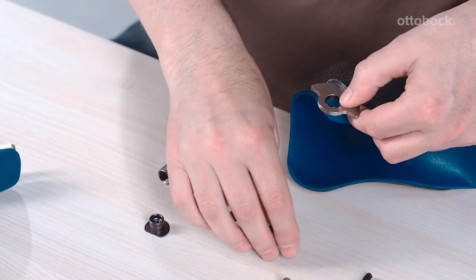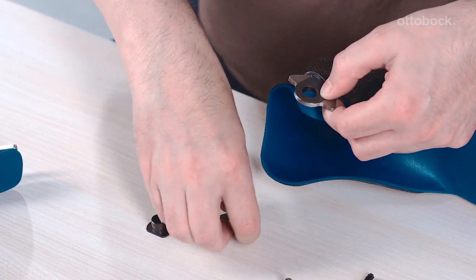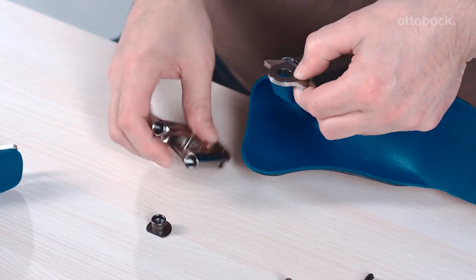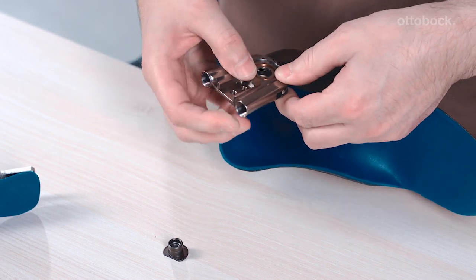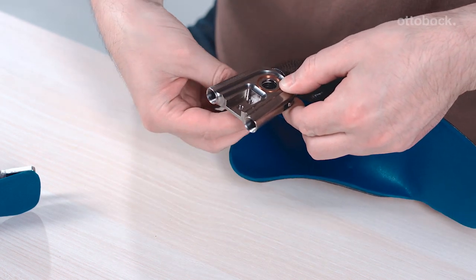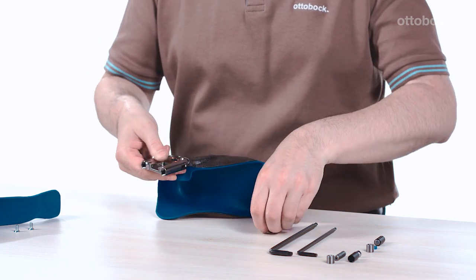First, the basic piece must be installed on the foot stirrup. Reinsert the bearing bushing into the foot stirrup. Then place the two axial washers on the foot stirrup. Slide the foot stirrup together with the axial washers into the basic piece.